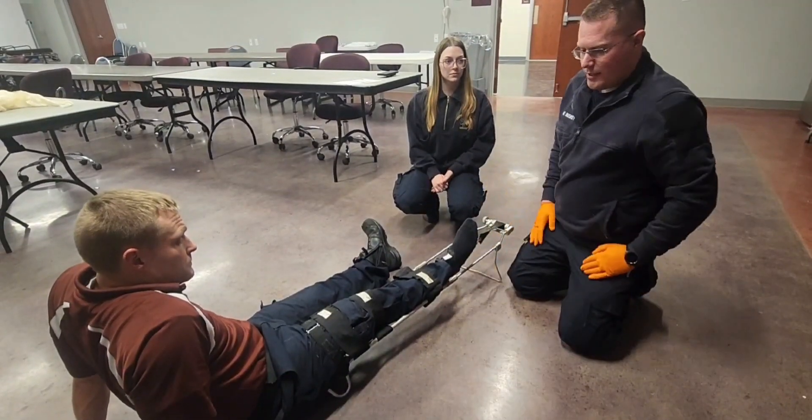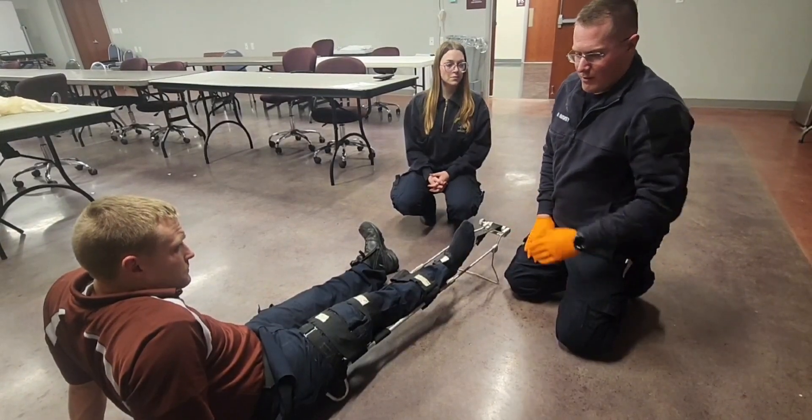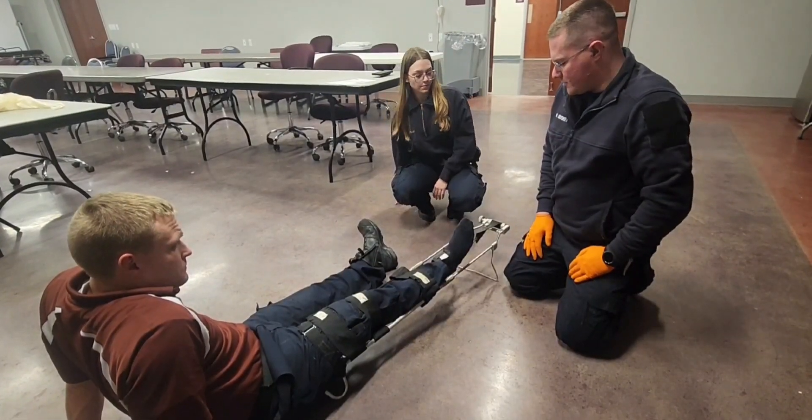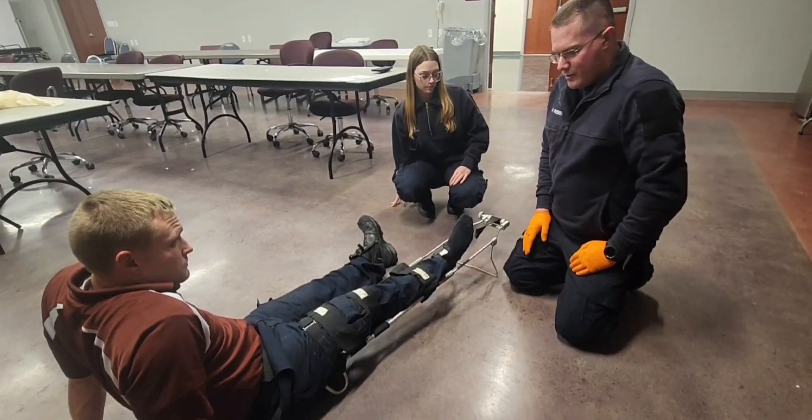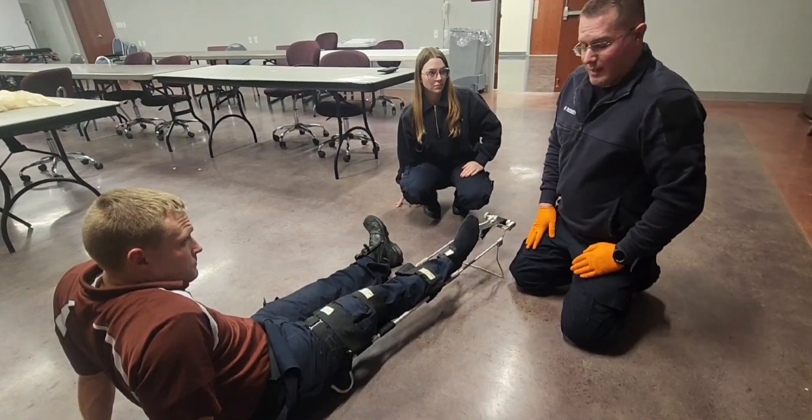I'm then going to secure him to a backboard so that we immobilize the hip with the backboard. I'm going to then secure the backboard to a stretcher, and I'm going to load the patient in probably backwards so that his head is at the foot end of the stretcher so that this fits inside of the ambulance.